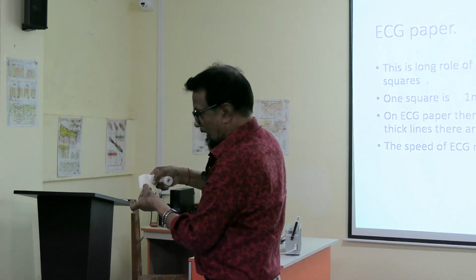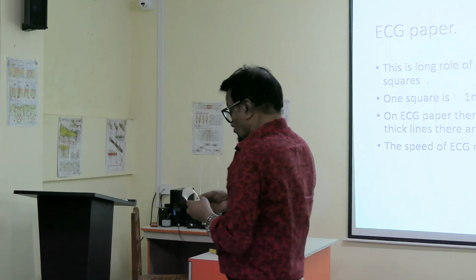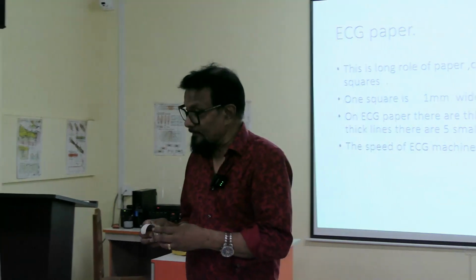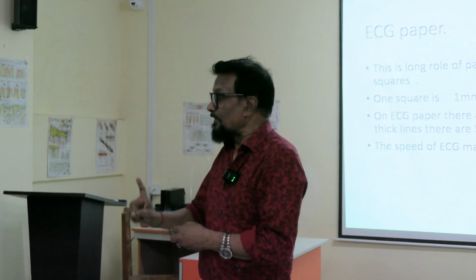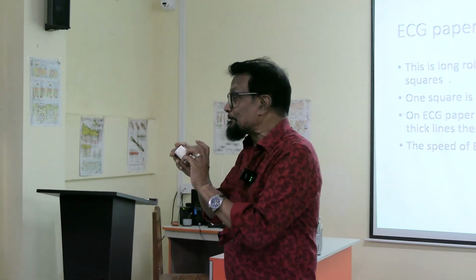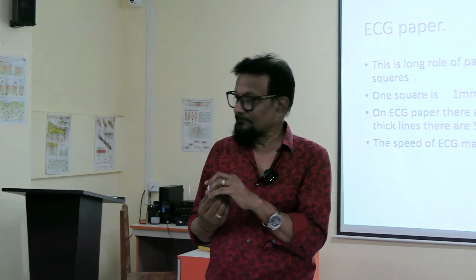First, we have to know the speed of movement of the paper in the machine.